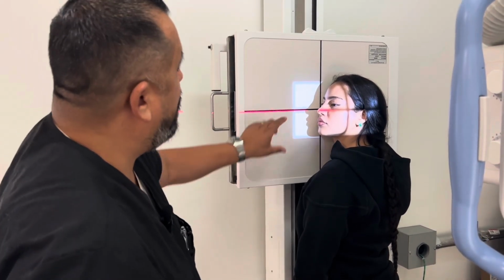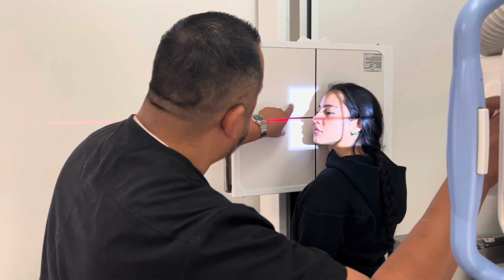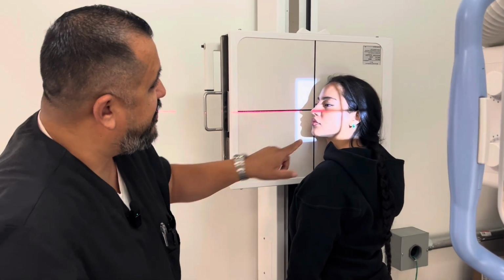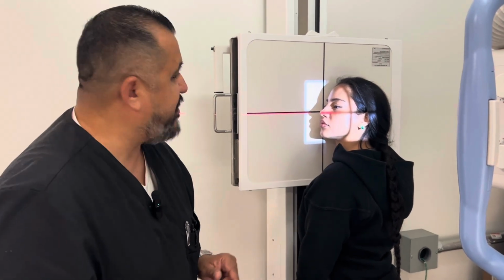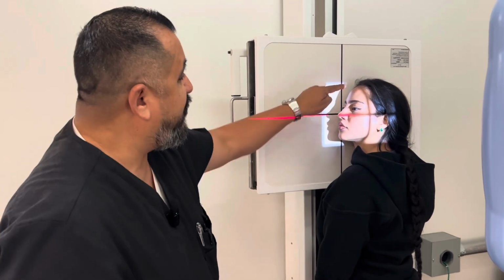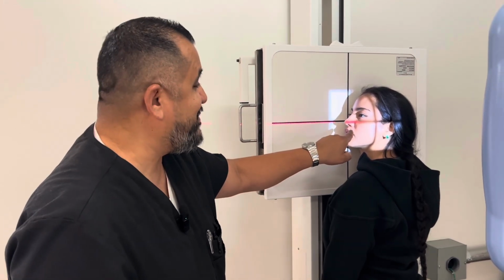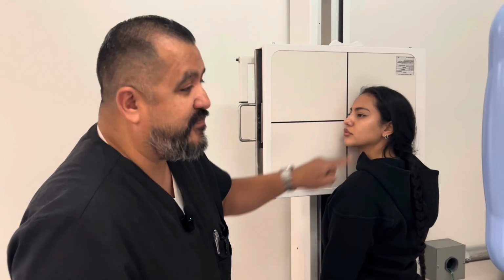So now we're going to put the right marker here because it's a right lateral. I'm going to come down just a little bit in collimation, just like that. So you're going to get the frontal sinus up here. You're going to get the maxillary sinus. You're going to get the ethmoid and then the sphenoid sinus in the back. So remember that your sphenoid sinus is going to be most posterior. Your frontal sinus is going to be the most superior. The maxillary is going to be the most anterior, I guess you could say. And the ethmoid will be found between the frontal and the maxillary.